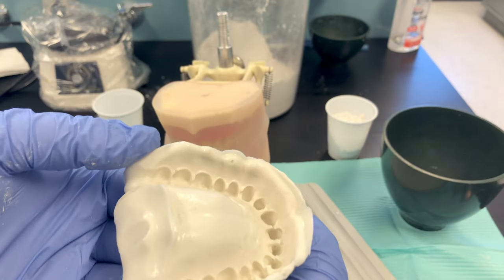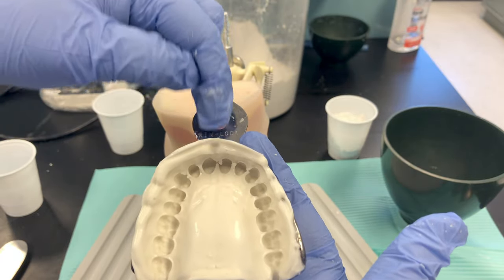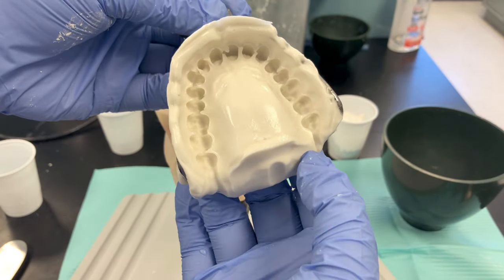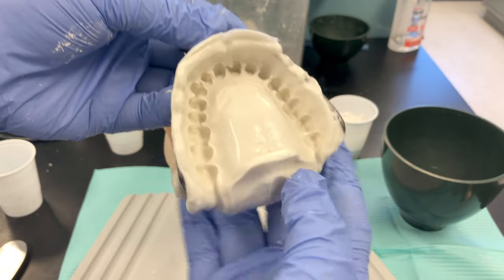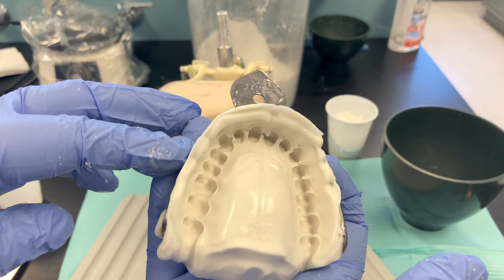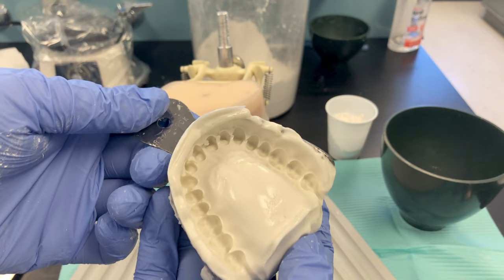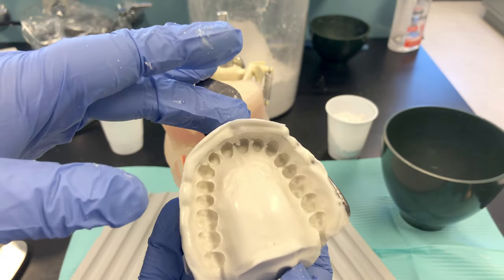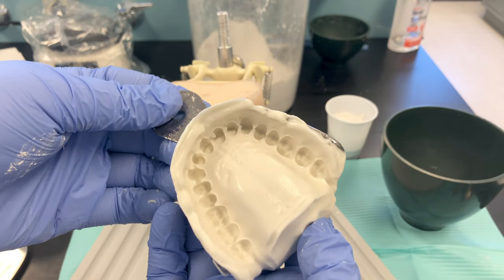Inspect your impression — look for detailed anatomy with no voids or bubbles. The impression should be centered in the tray with the two centrals at the center, and all teeth captured including the tuberosity area. There was a little distortion in the tuberosity area where the material didn't flow back well. A nice peripheral roll around the border is what you want. This would make a nice study model. When it comes out of the mouth, rinse it — there may be blood or food particles.